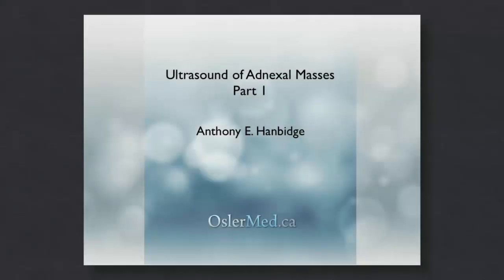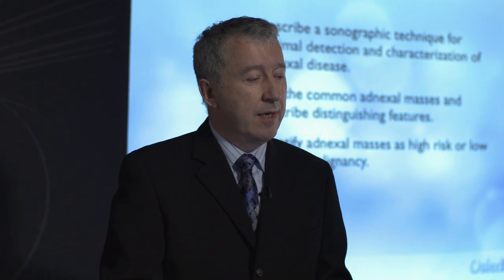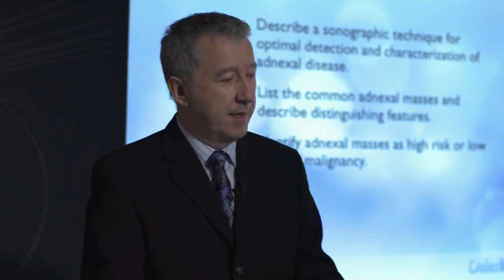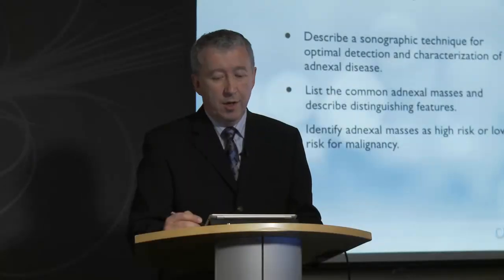And today we're going to discuss ultrasound of adnexal masses in two parts. Our learning objectives will describe a sonographic technique for optimal detection and characterization of adnexal disease. We'll list the common adnexal masses and describe distinguishing features, and we'll identify adnexal masses as high risk or low risk for malignancy.